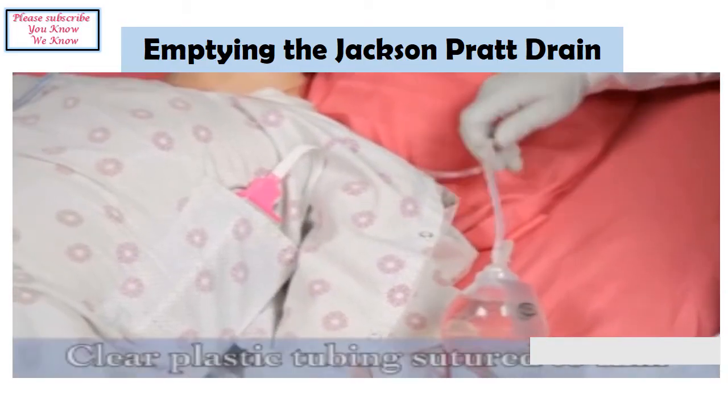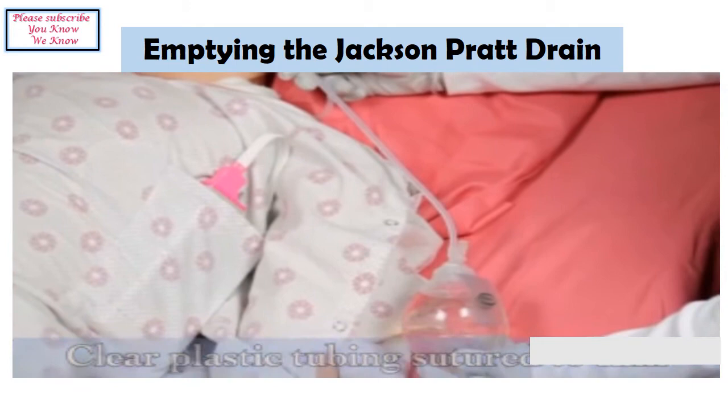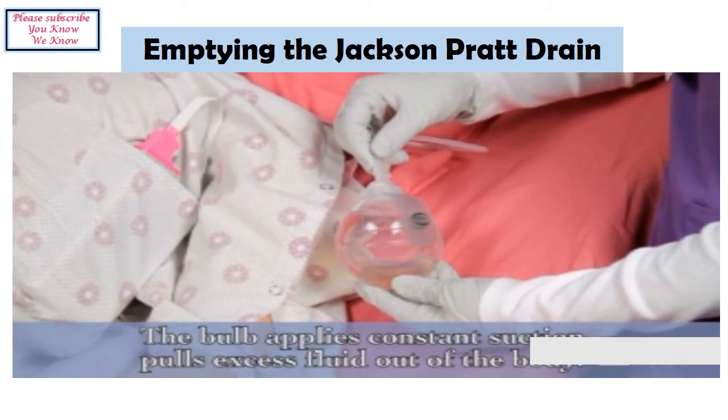Jackson Pratt is a closed drain system consisting of a clear plastic tubing sutured to the skin and a bulb. The bulb helps in collecting the drainage. The bulb applies constant suction pressure which pulls excess fluid out of the body.